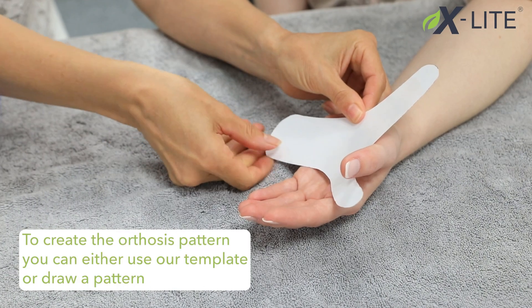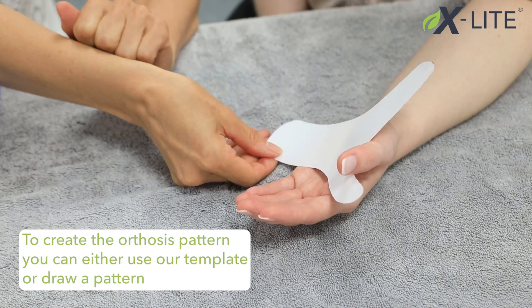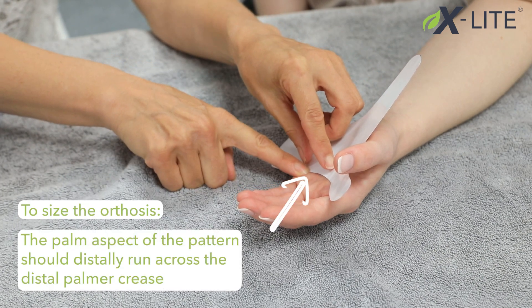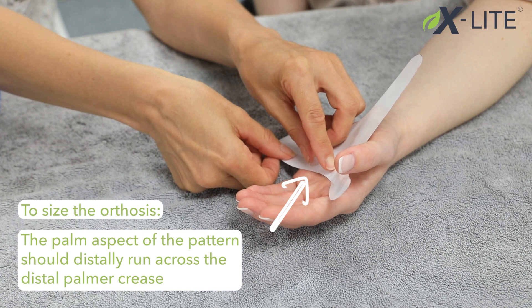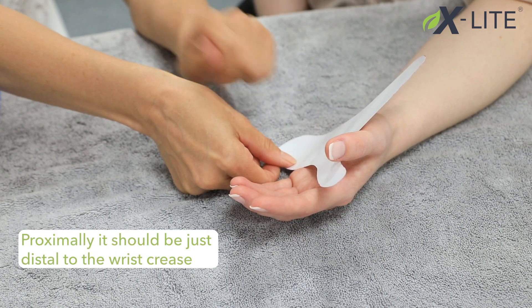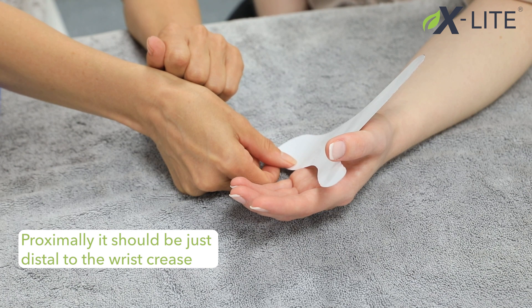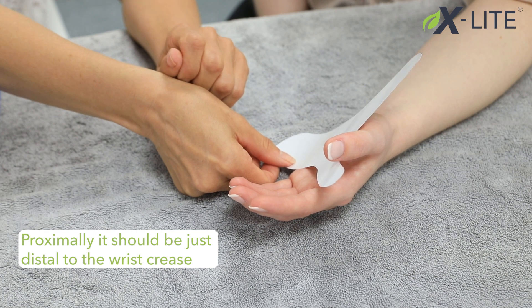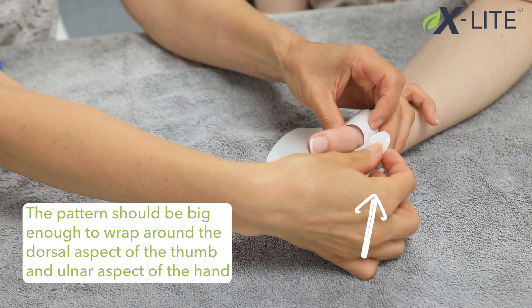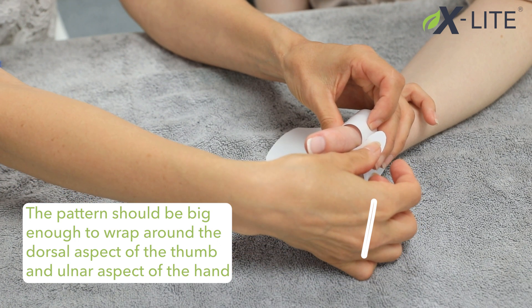To create the orthosis pattern you can either use our template or draw a pattern. To size the orthosis, the palm aspect of the pattern should distally run across the distal palmar crease, and approximately just distal to the wrist crease. The pattern should be big enough to wrap around the dorsal aspect of the thumb and ulnar aspect of the hand.